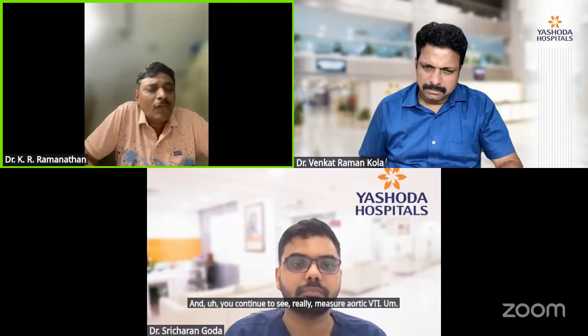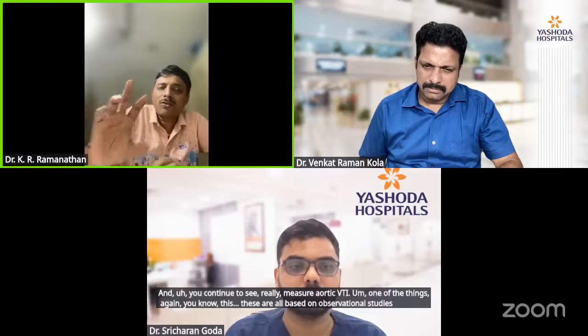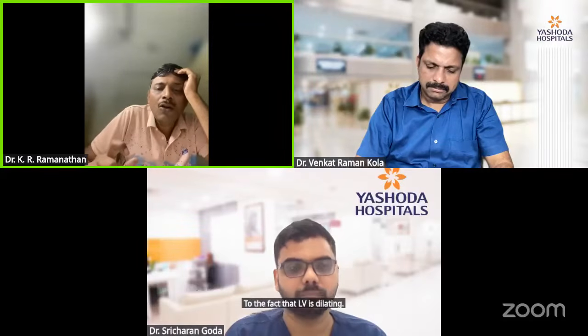When a patient goes on ECMO and you continue to serially measure aortic VTI, again, these are all based on observational studies and small case series where people have looked at various yardsticks, a serial reduction in aortic VTI as the ECMO run proceeds might be an indicator that the LV is dilating or the LV is unable to eject better.